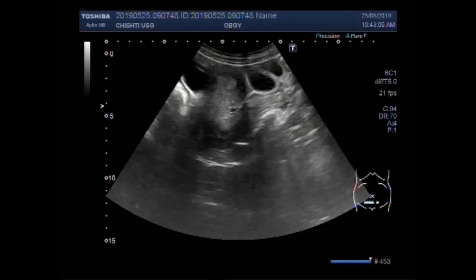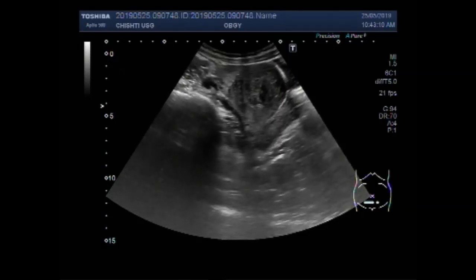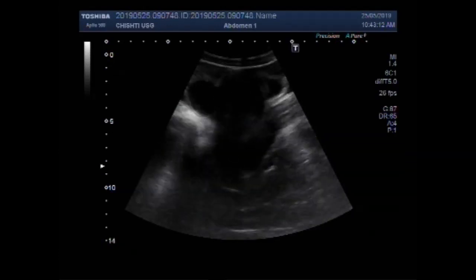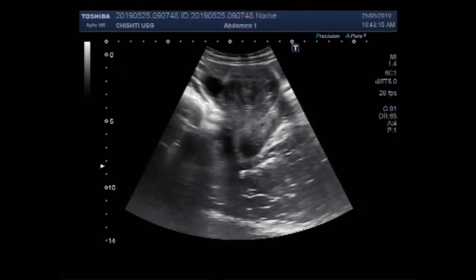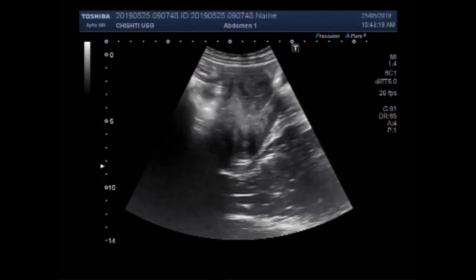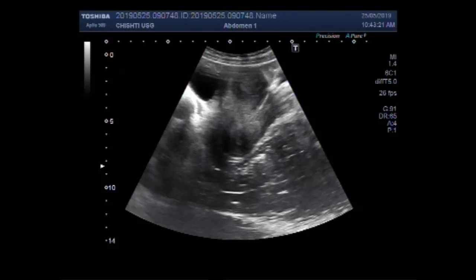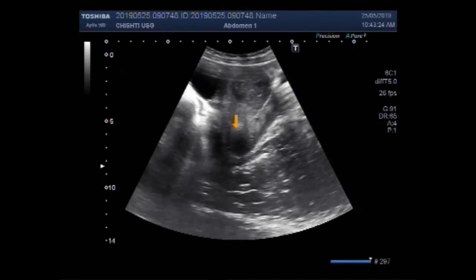Dear viewers, now you can see another video showing a uterine mass along with an ovarian cyst. You can see the uterus — an anteverted uterus — and the uterus and cervix.